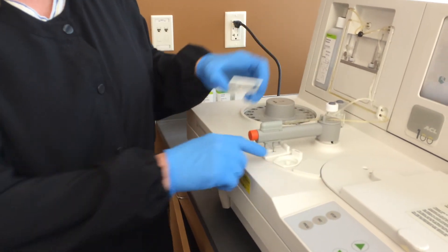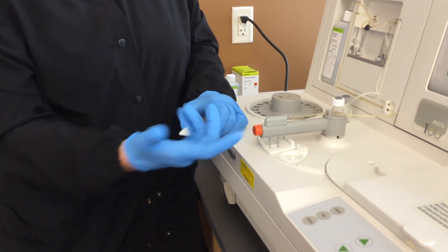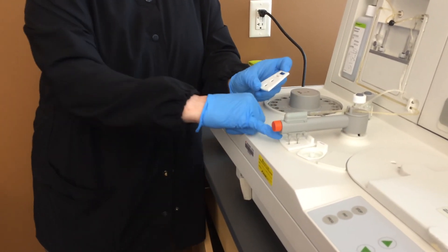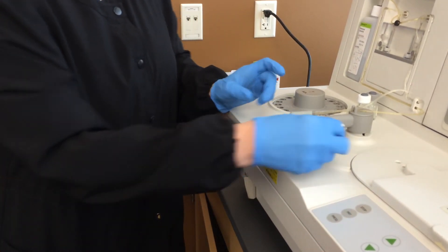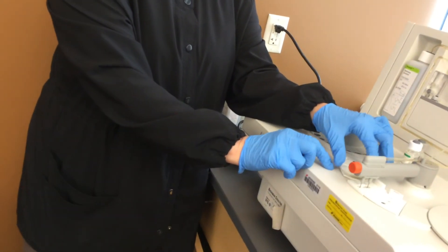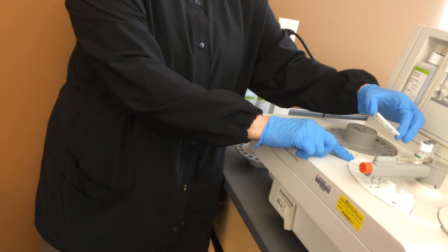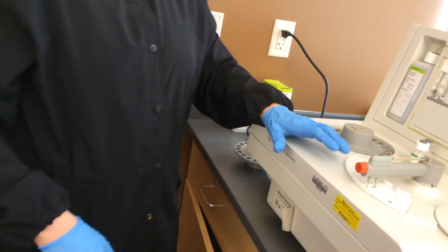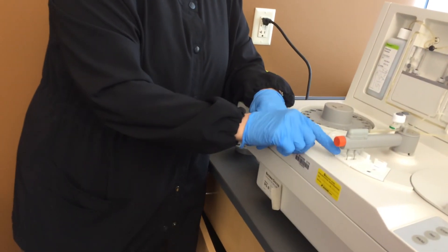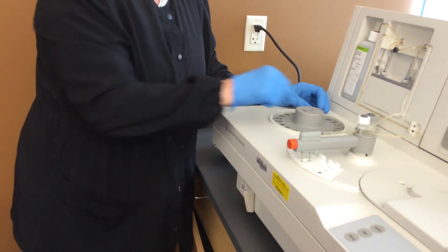The calcium chloride has that opening in the center, and what that's telling you is the front probe is going to aspirate the calcium chloride, but the back probe is going to aspirate the PTT or the PT reagent. Also, the front probe is the one that samples the patient.